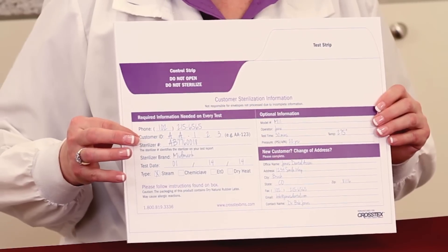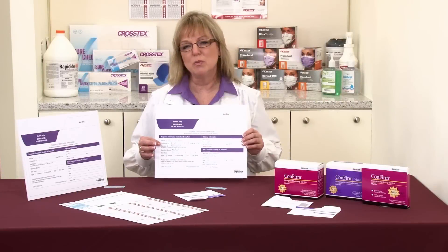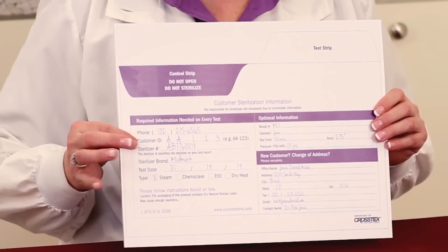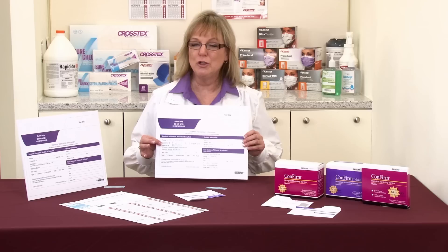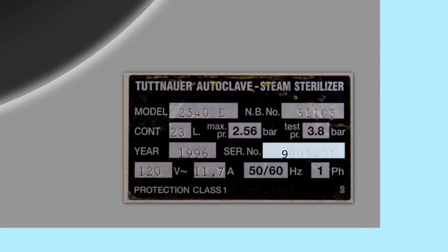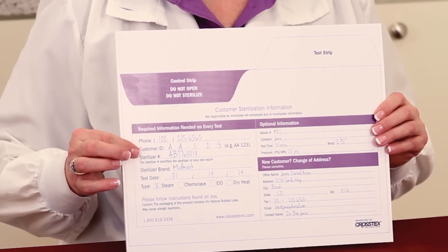The next important point is the sterilizer number. Especially if your office has more than one sterilizer, it's important to associate the correct test with the correct sterilizer. When looking for the sterilizer serial number, you're going to look on the back of the unit, or on the front of the unit as you open the door, usually to the bottom right side — you'll see a metal tag. It's important that you keep this sterilizer number consistent each time that you send a test in.